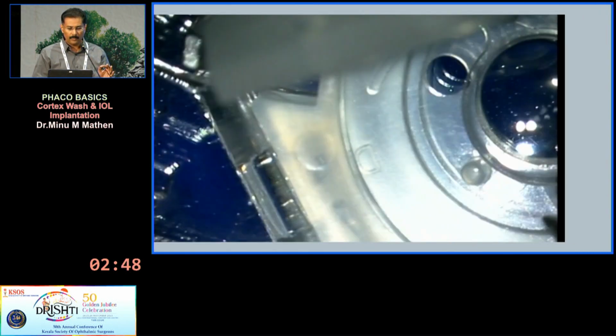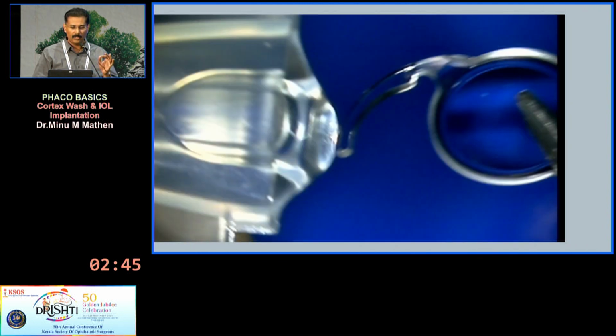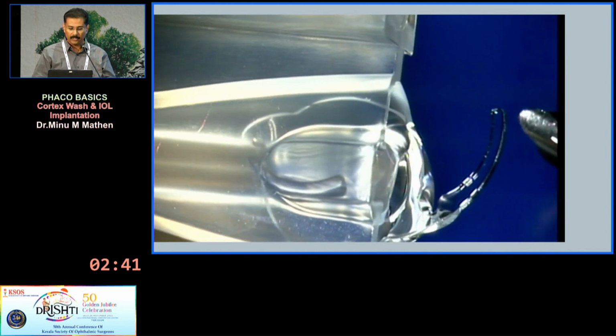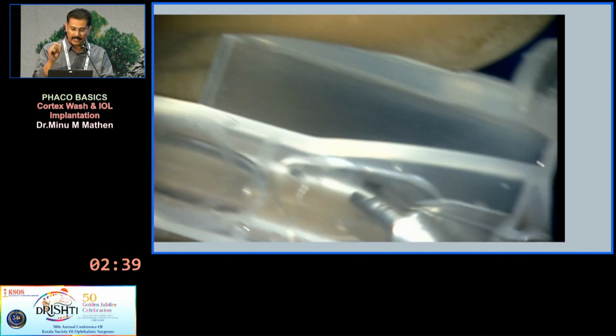And one thing we need to avoid is to hold the lens at the center. Do not hold the center of the optic. Hold only at the haptic-optic junction, because otherwise it will leave marks on the optic.